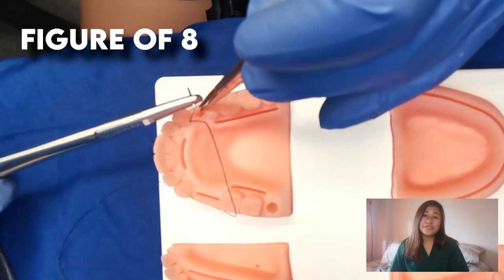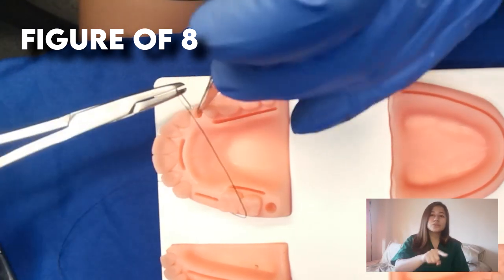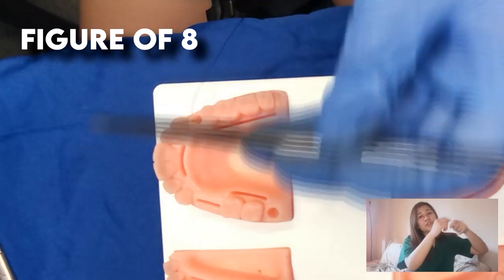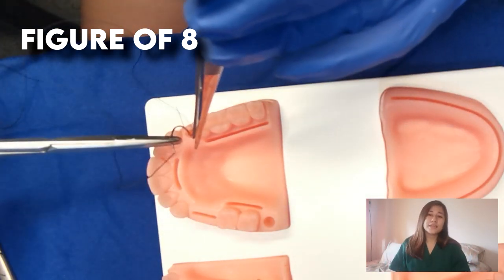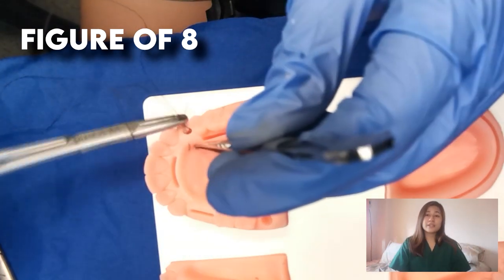So with the figure of 8, we have a pattern that goes 1, 2, 3, 4, and then we go back to 1. That's where you put your knot, at the buccal side, so that you can remove it easily. You can see the knot from the clinical view.